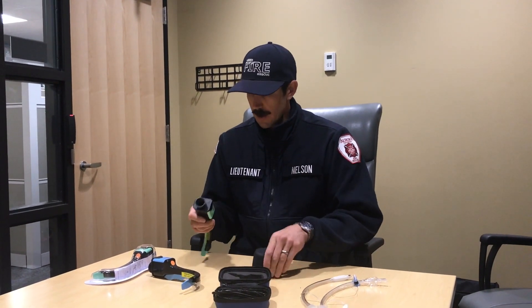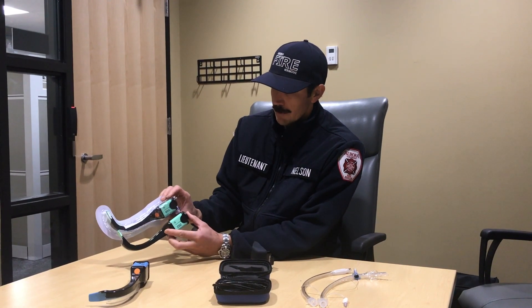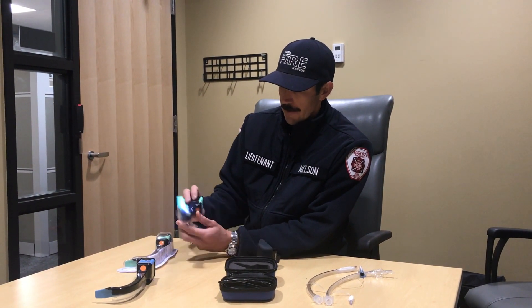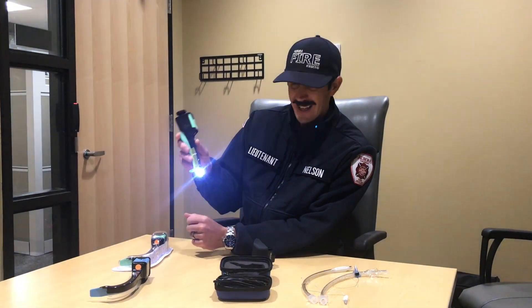This is the primary method you're going to use to set up this intubation equipment. You're going to remove the AirTrack blade from the package and turn the orange light on. This is going to turn the light on at the tip. You may see a strobing effect — what that's doing is heating up the tip of the blade, which reduces condensation during your intubation attempt. This heating can take anywhere from several seconds to 30 seconds.